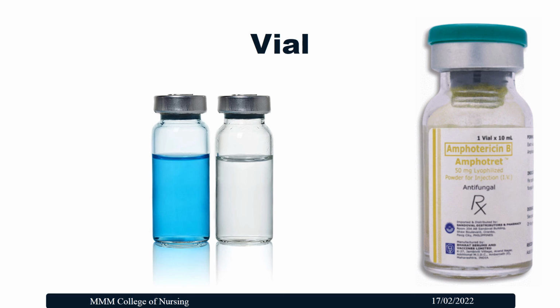Vials are sterile glass containers having injectable medicine in the form of powder or liquid. It can be packed as a single dose vial or multi-dose vial.